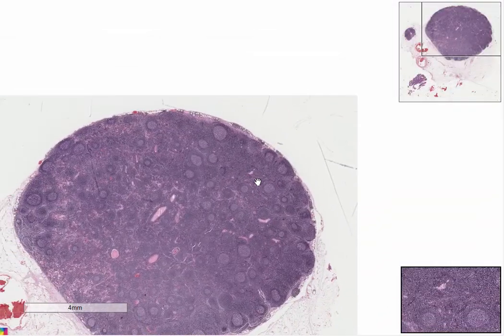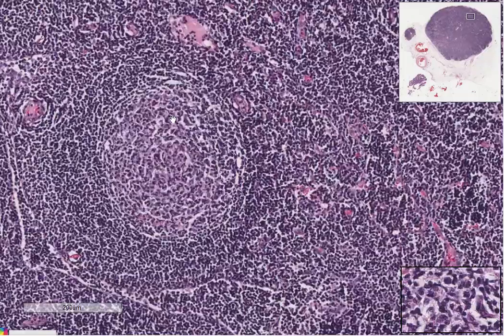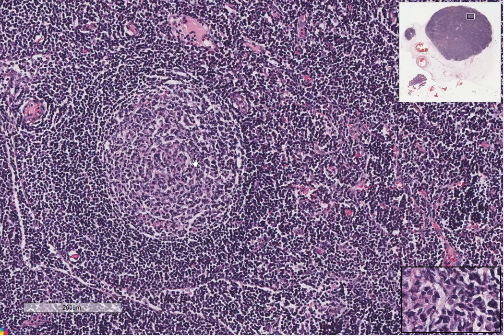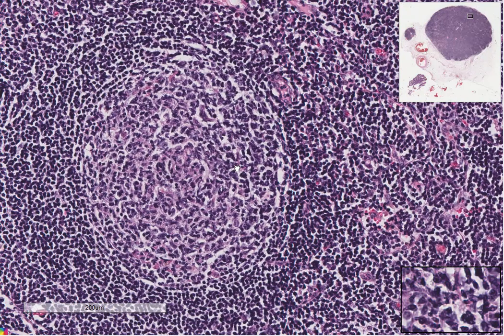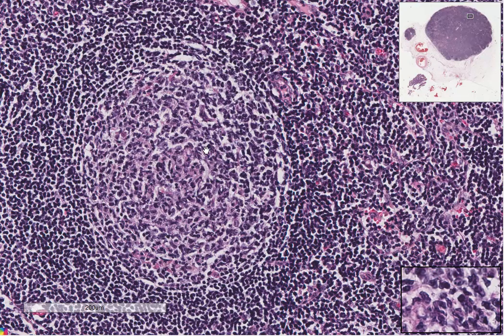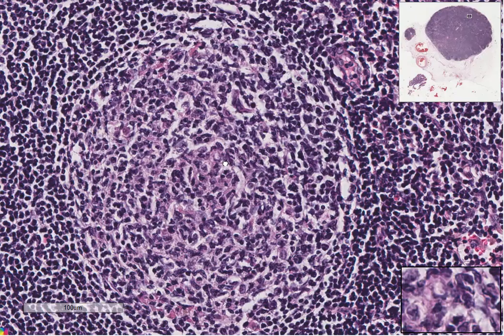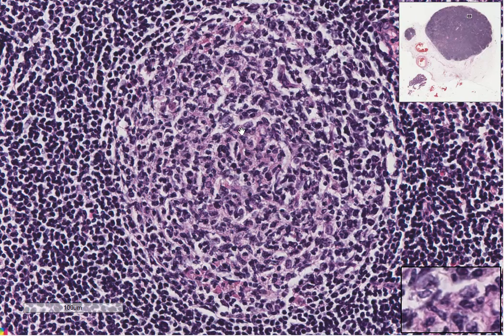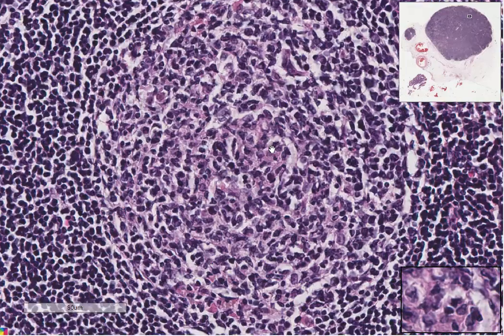Okay. So germinal centers don't only have B lymphocytes, which are abundant here. They also have macrophages, which I showed you, which are CD68 positive. They also have follicular dendritic cells. Okay. And there are also a few T lymphocytes. If you stained with CD3, you'll find that they may light up as well.